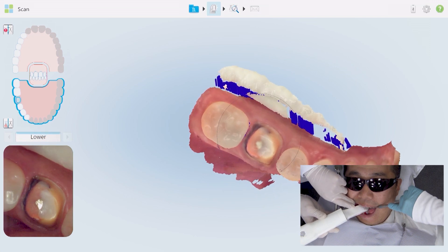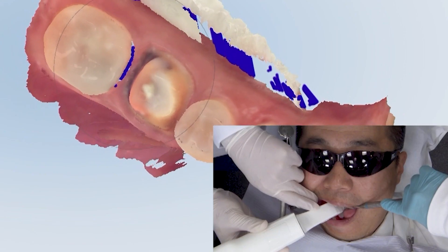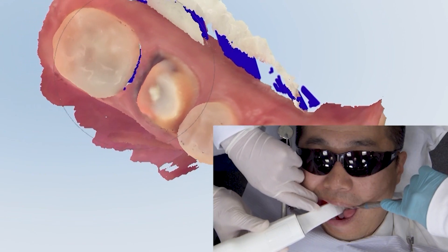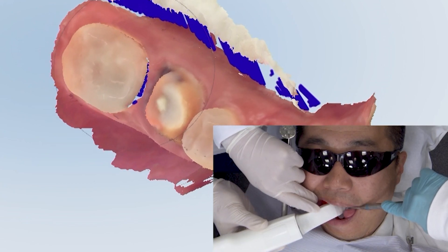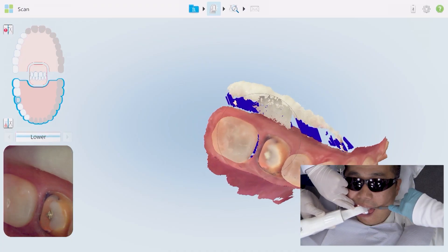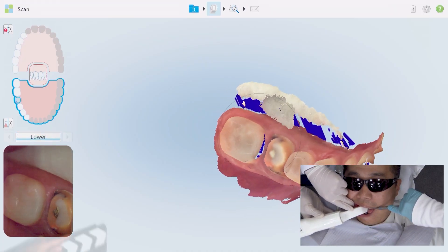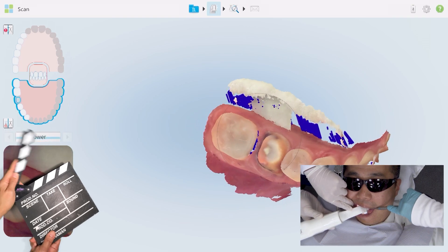As the body rotates out on the buccal side, I'll rotate the camera, the head of the camera, to allow the light source to come into contact with that undercut.